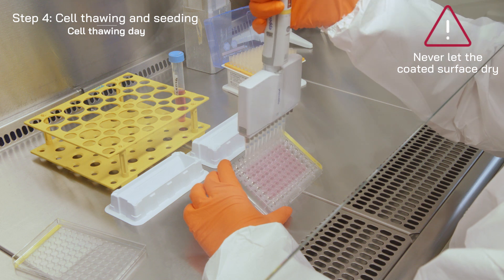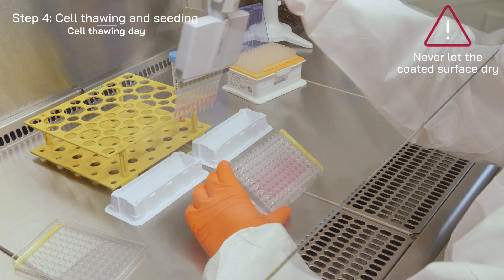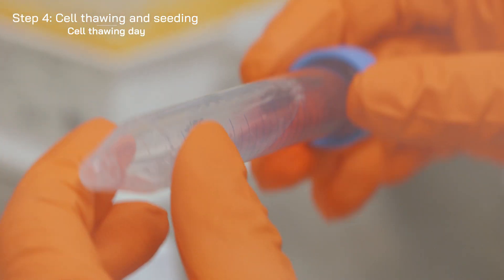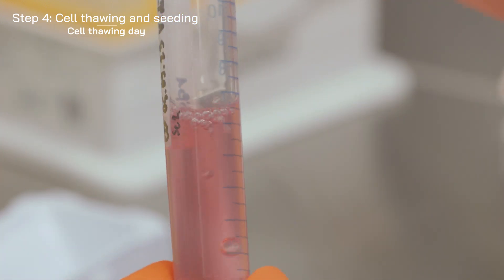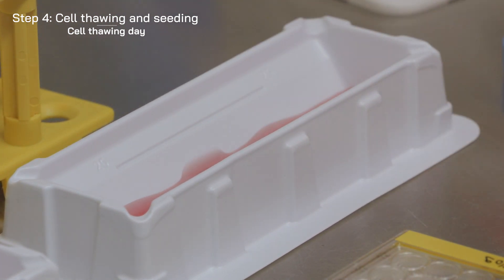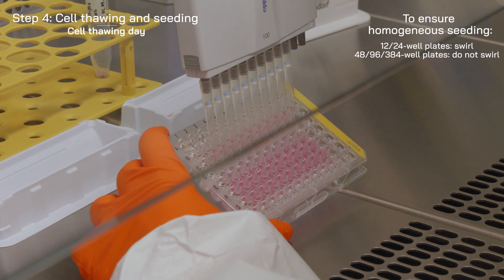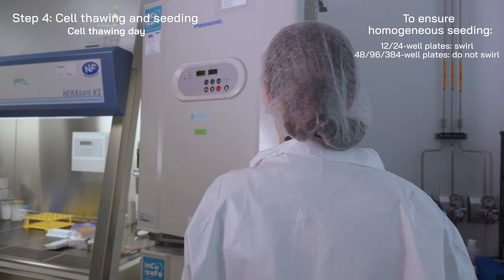Remove the coating reagent from the wells. Homogenize the cell suspension by gently inverting the tube several times and proceed to seeding immediately. Incubate at 37 degrees Celsius.